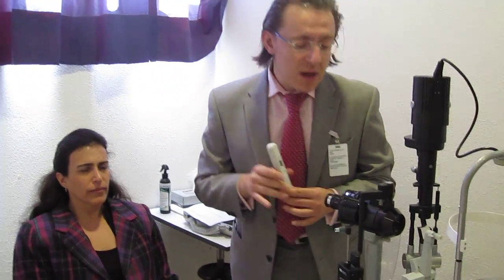Thank you, Angela. How did you feel? Not bad. This tonometry method allows you to obtain intraocular pressure independent of the corneal properties — so this is the non-corneal tonometry.